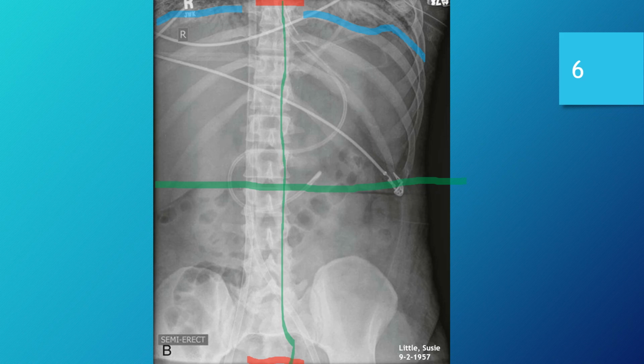And then in terms of inferior, superior, if you look at my reference line, it's relatively close to the middle of this image, and they did not. I'm going to have to guess that they used the inferior portion of the ribs as a centering point for this exam, and that didn't work out so well. As I said, anatomy is missing from both aspects, supine or erect.